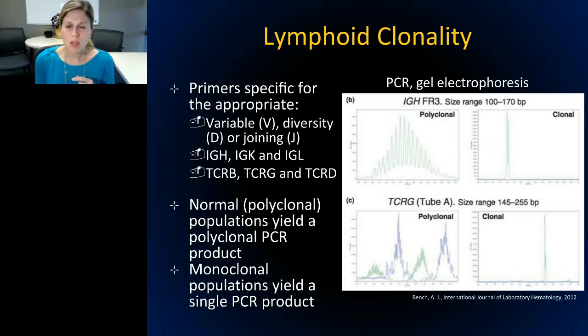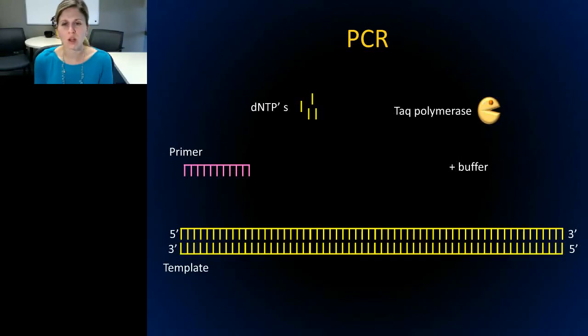Looking at a clonal population, you see one peak. So that would be representative of that previous slide where we just saw all these blue circles, representing an accumulation or a clone of those lymphocytes. And this is problematic because it's suggesting that we have far too many cells that have the exact same gene rearrangement, and therefore there is a mitotically active precursor that has gone a little bit wild and is making far too many copies of itself, and the outcome there is a clone.